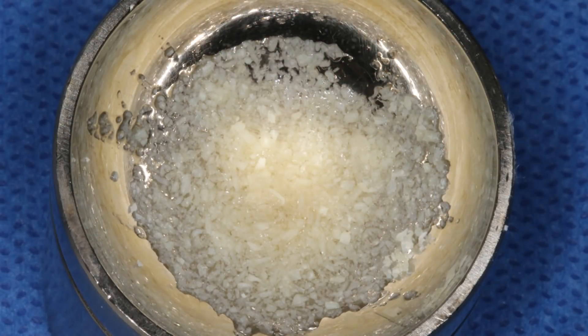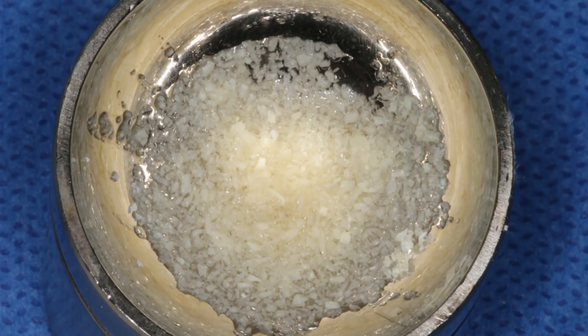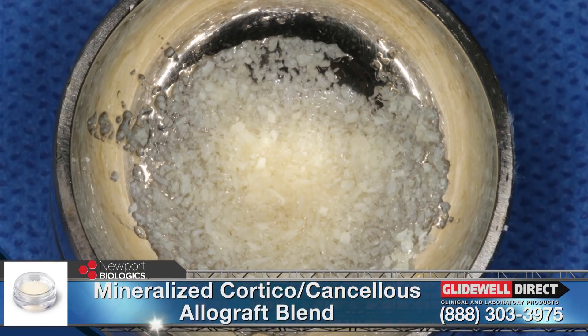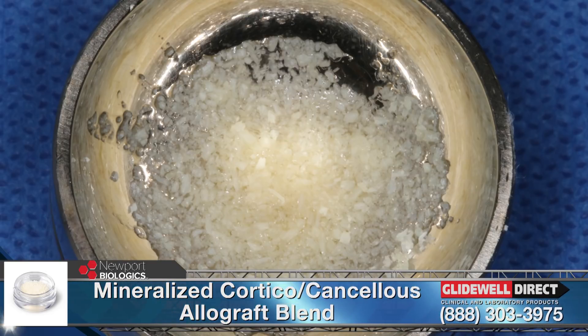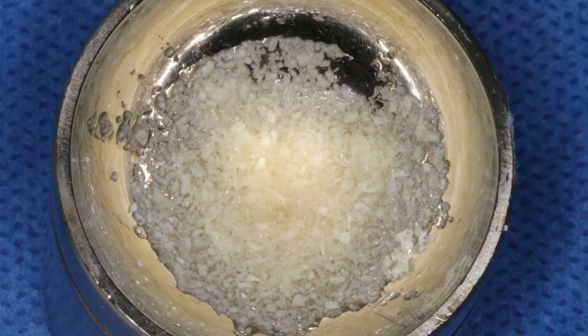The allograft material was dispensed into a sterile dappen dish. This mineralized cortical cancellous allograft blend is well suited for this situation, as the range of particle sizes allows for a mixed resorption rate by the osteoclasts responsible for bone growth and healing. I personally prefer to wet the allograft material with sterile water. This allows for ideal handling characteristics when transferring the graft material to the surgical site. The membrane was then trimmed to a size that covered the defect and engaged healthy bone more than two millimeters past any defect on the facial and palatal aspect.